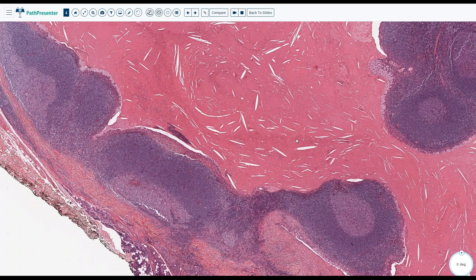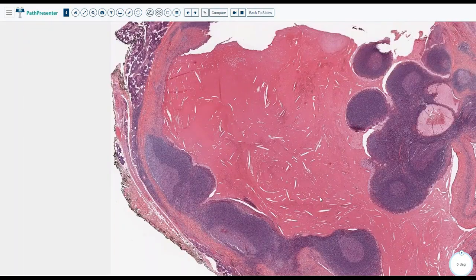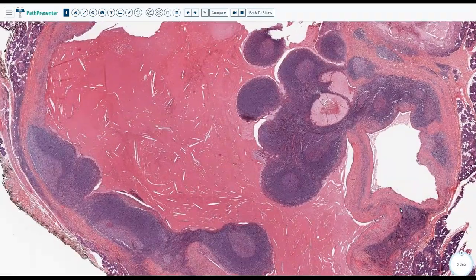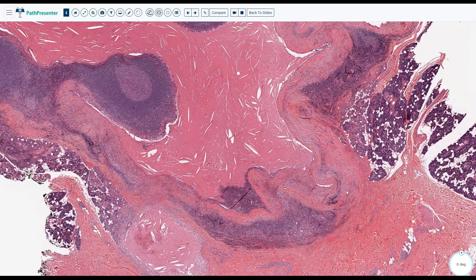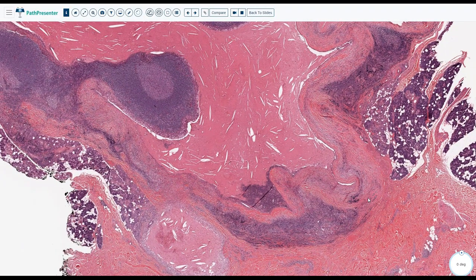What we're going to think of in these circumstances, that you are dealing with, you'll be thinking of metastatic squamous cell carcinoma. At least you will say, well, there is atypia, and the surgeon says, okay, I'm not going to risk it, because of the two, one is benign, no problem. One is, okay, this is a big deal. Probably there's something. We're just going to take it away if you're not comfortable.